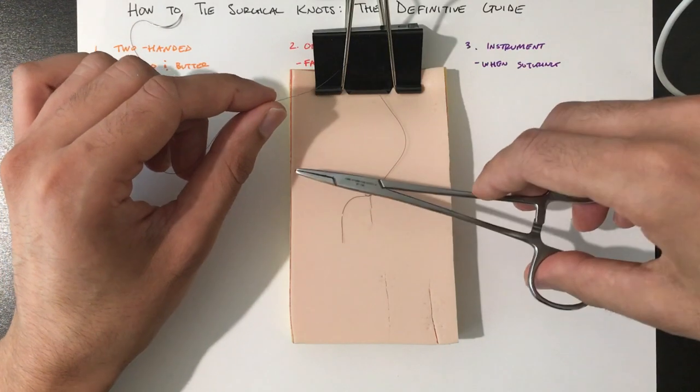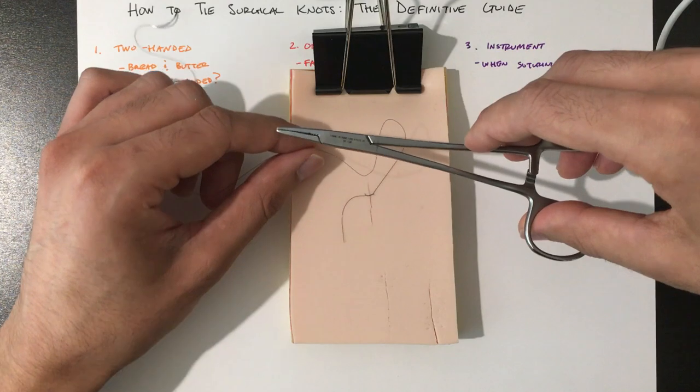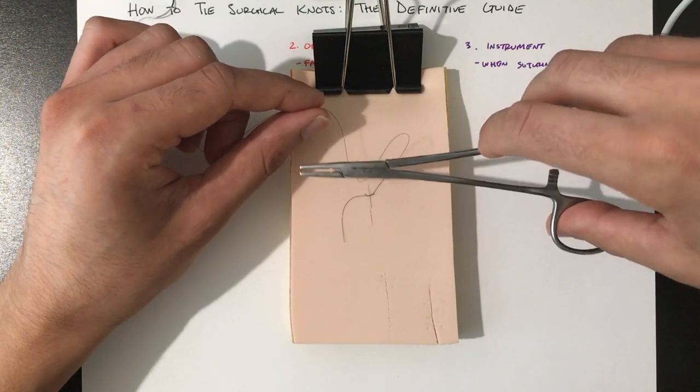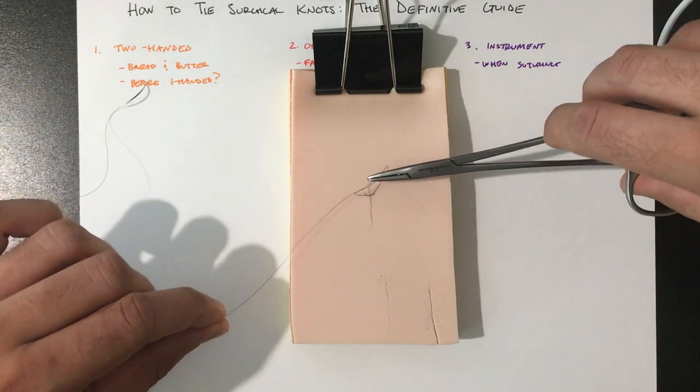So again, needle in the middle, this is the opposite way now. Wrap from outside in, grab the short end, and pull up.